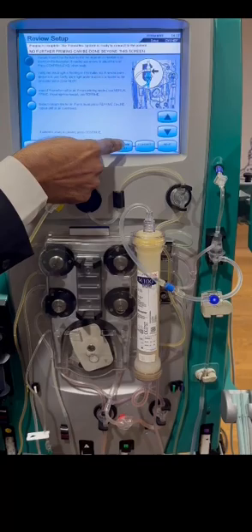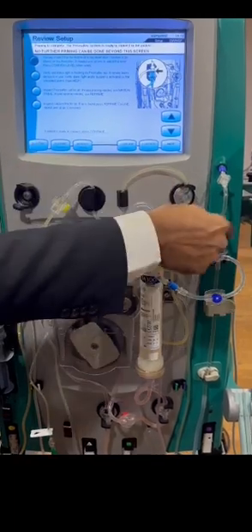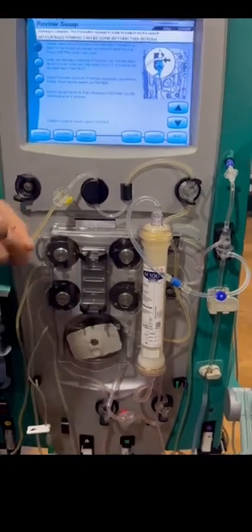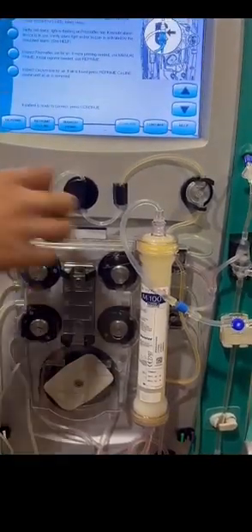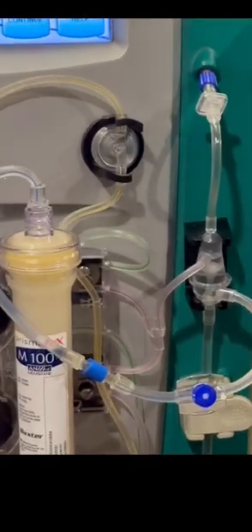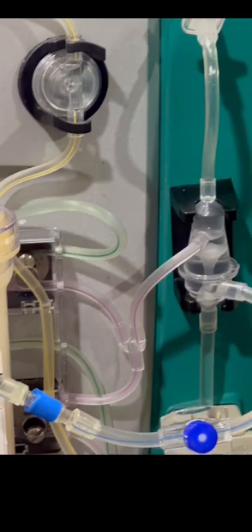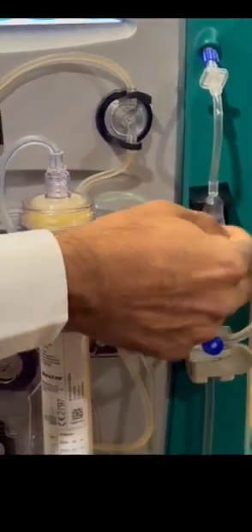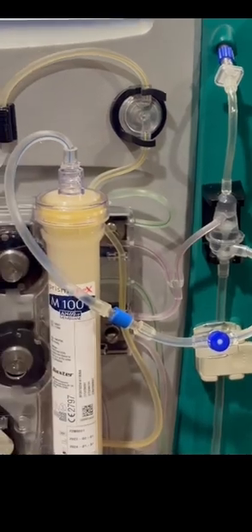Then confirm the level. Okay, in between therapy also we can adjust that. While connecting, maybe some air comes, there is a chance, multiple times we are removing. Then in between therapy also we can adjust this. What is the optimal level? Here there is a mark. Okay, at least make it there. If some air will come, then in advance we can make it till here also. Okay, that will accumulate over here.